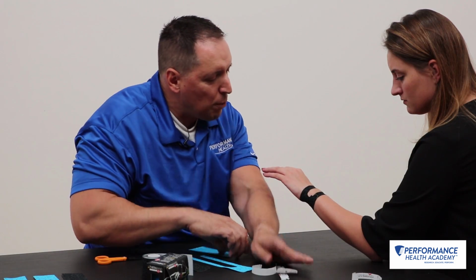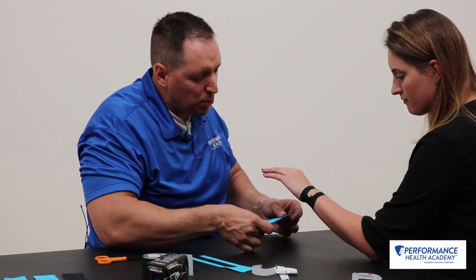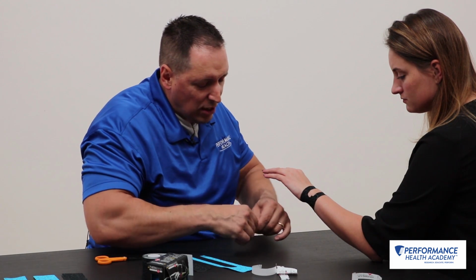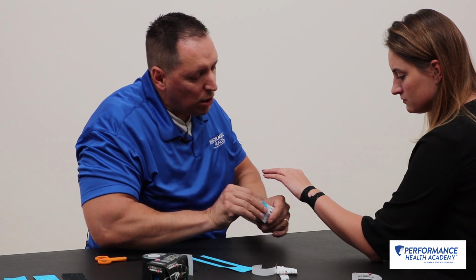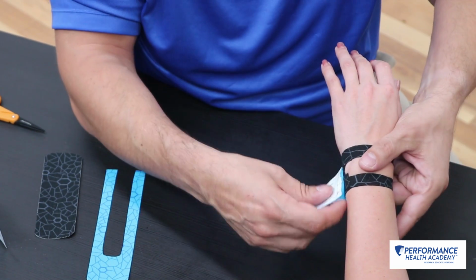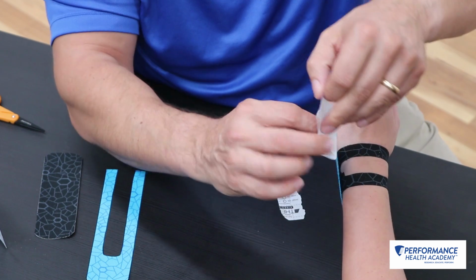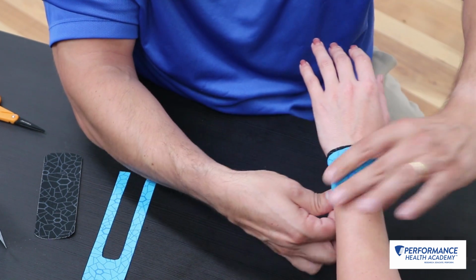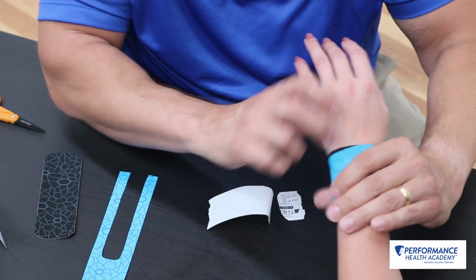If you want to add a second piece to that to give a little more ulnar joint stability, then what you can go ahead and do is an I strip. Probably an 8 to 10 centimeter I strip. You'll bring it over top of this and lock that wrist in. I give about 50% tension with this here and wrap that right around and lock in on the other side.